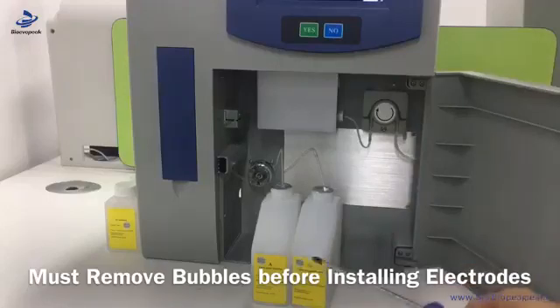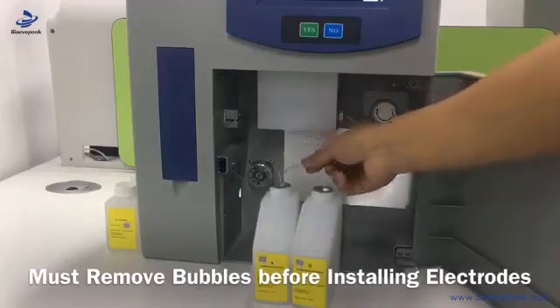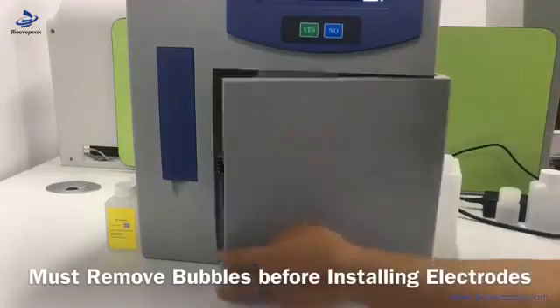This is solution A and solution B. We put the tube inside the box, then we put them at the right place. Then we can close the door.